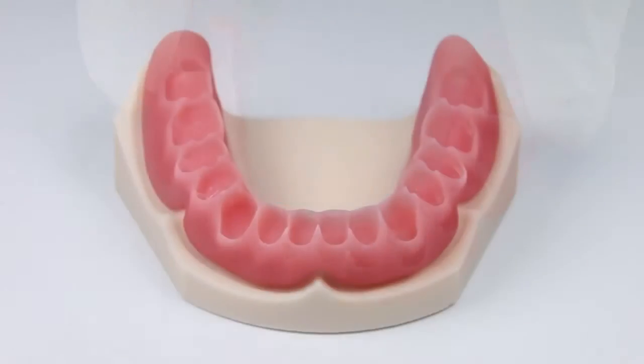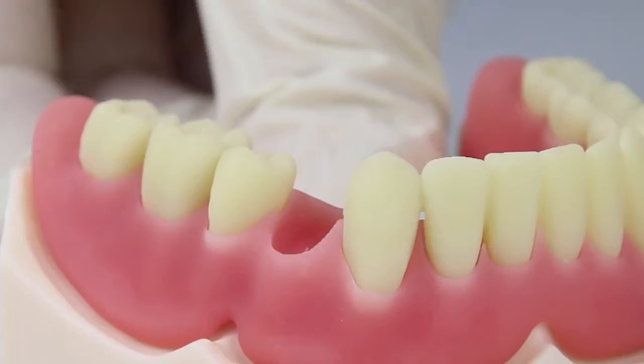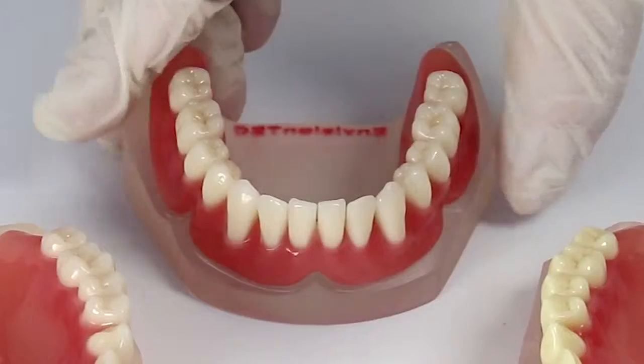Printed dentures out of the eDenture material can also be paired with standard stock denture teeth. You can easily adhere stock denture teeth to the denture base using common acrylics. The eDenture material, when paired with the Perfactory Vita, is the perfect tool for any state-of-the-art denture laboratory creating removable prosthetics.